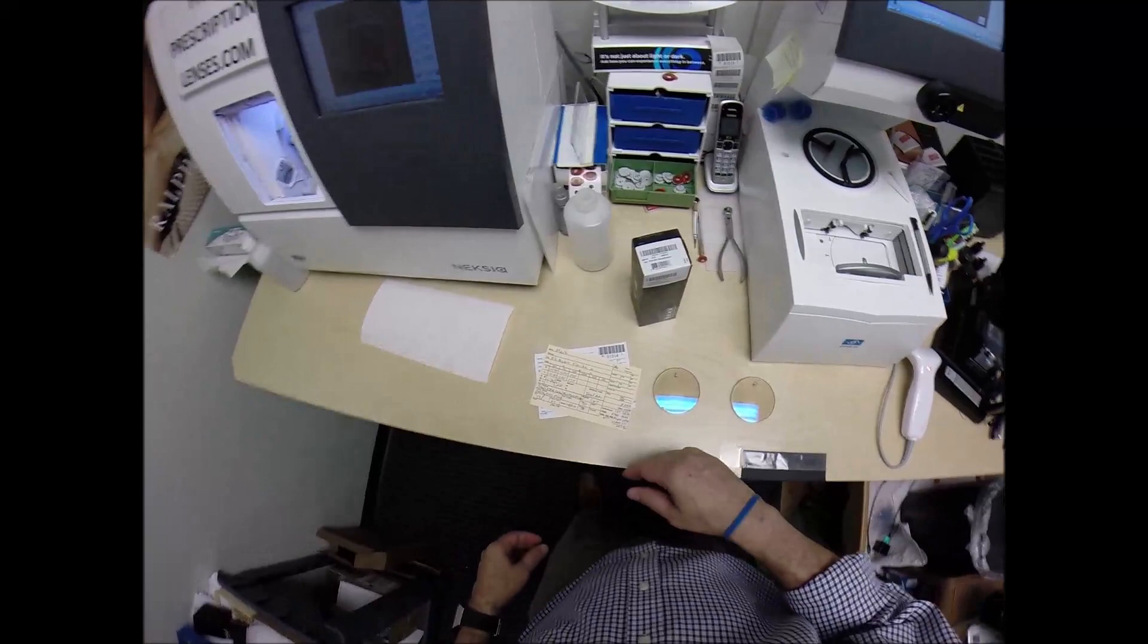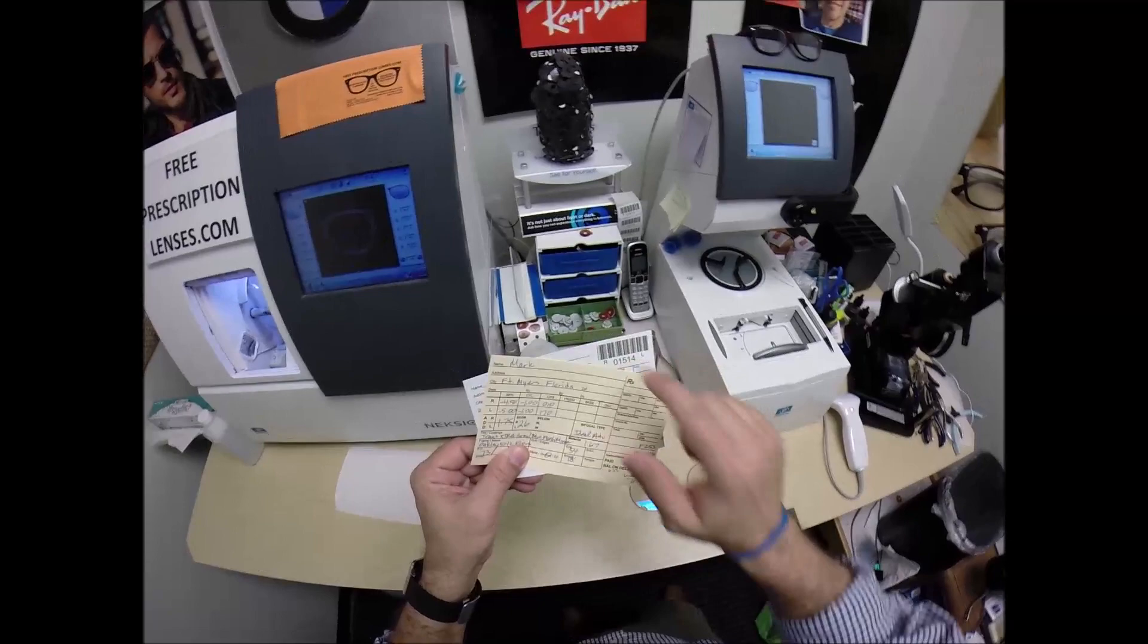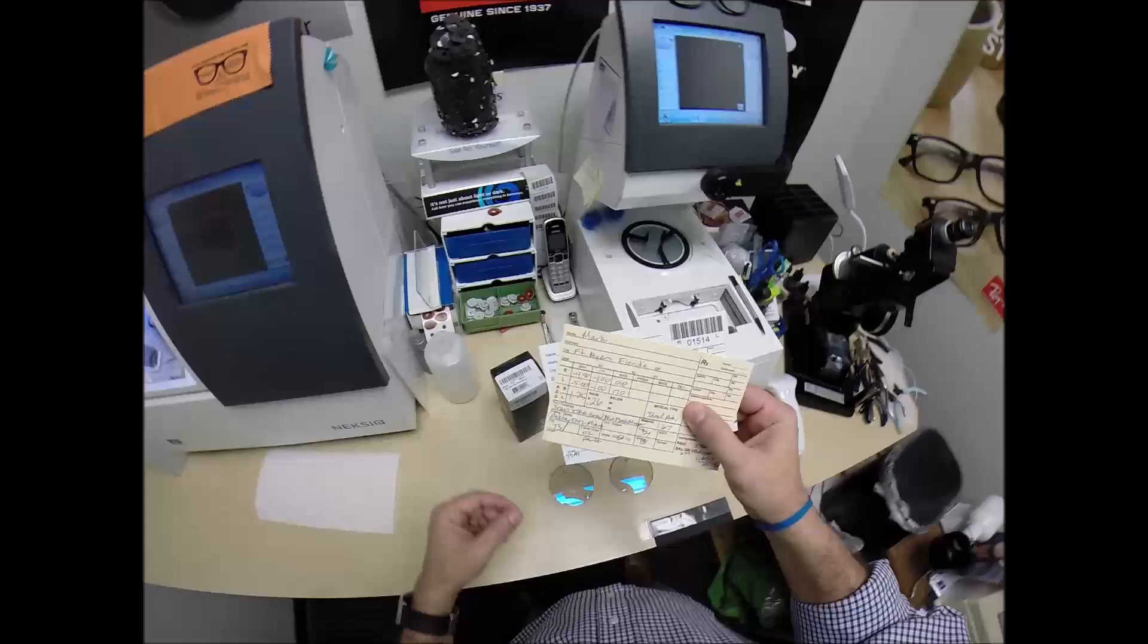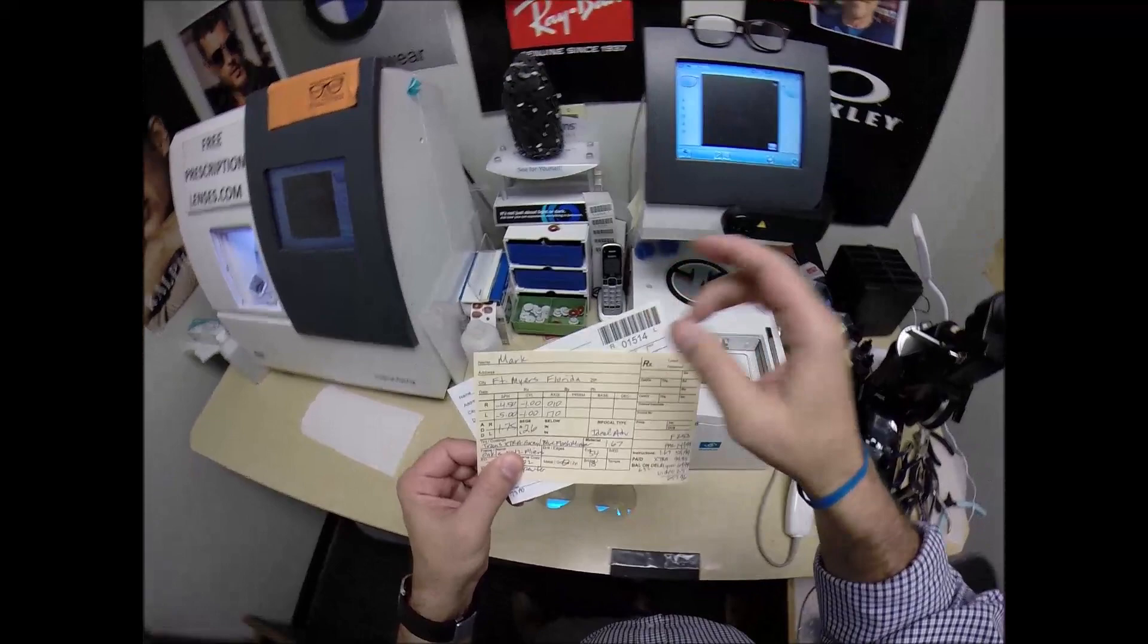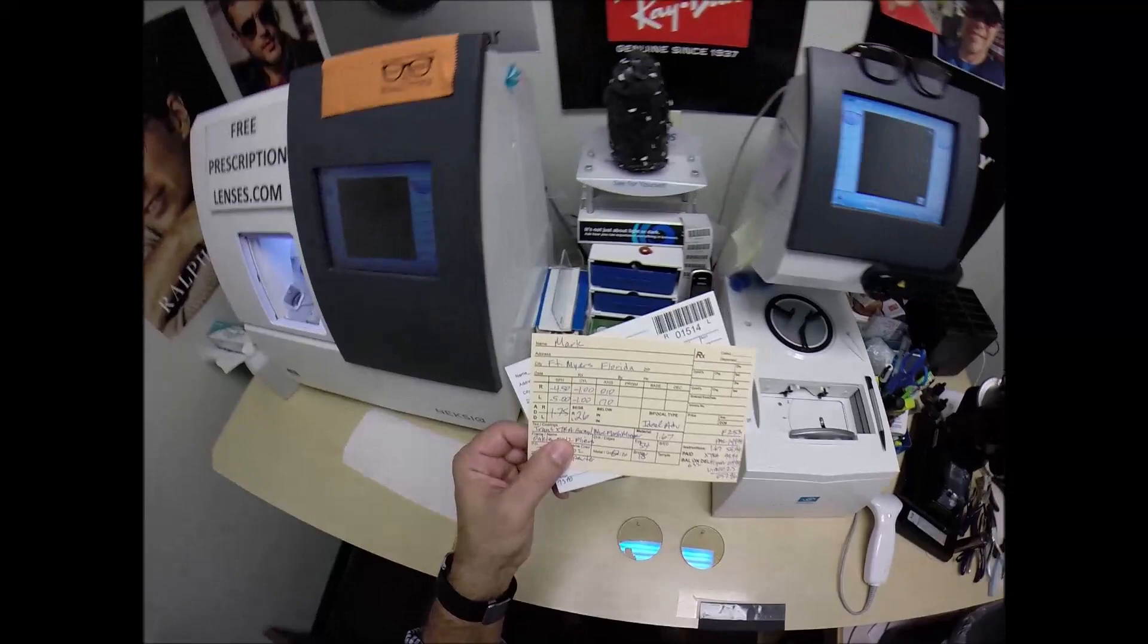And so let me get started. I'm going to be cutting high index progressive Essilor Ideal Advanced transitions extra active gray with the blue flash mirror. And I almost screwed up. I almost started cutting. I put the sticker on your regular card that has your address, email, phone number, all that stuff. Usually my cards are grayish white. The ones you see in my videos are this golden rod color. So I put the sticker on there. Then I realized you paid for a video. I was about to make these without doing the video. So I had to stop everything.